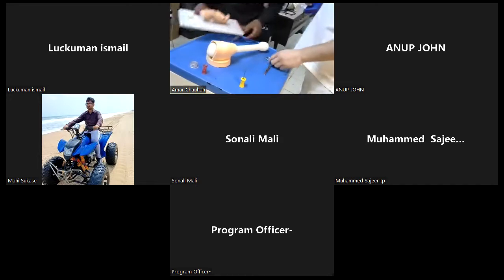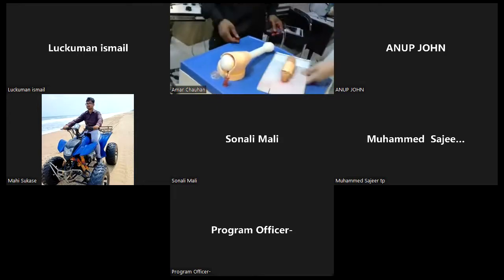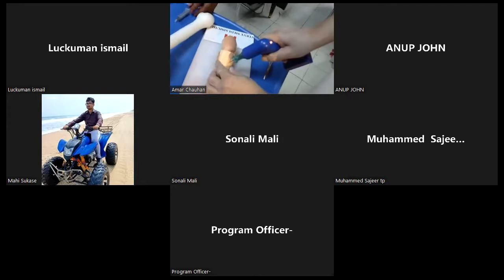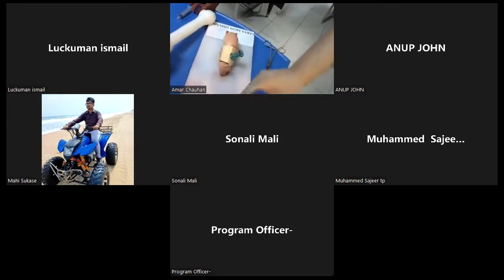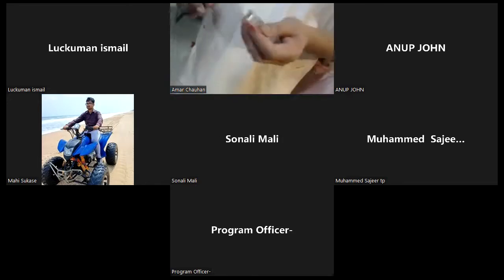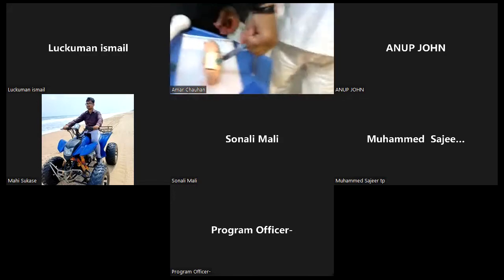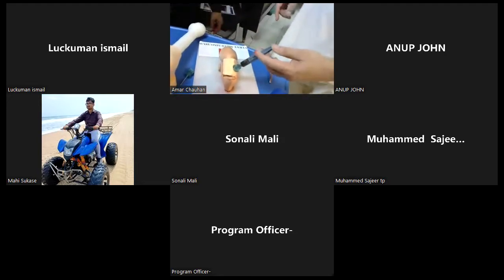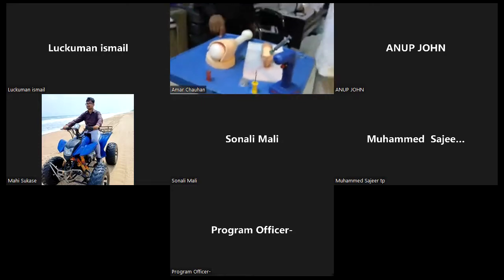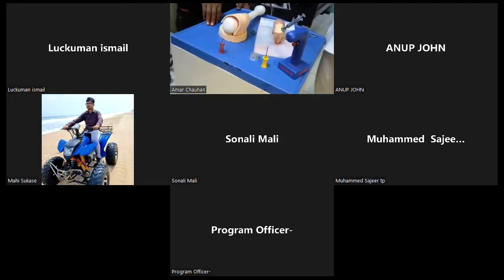And in between, they show the needle fixer. This is the blue one. Okay, so the needle fixer is separate. Okay, got it. For each dimension, there is a separate needle fixer, I think, right? Actually, we charge separately for the needle fixer. I don't know whether it has been shared with you or not.